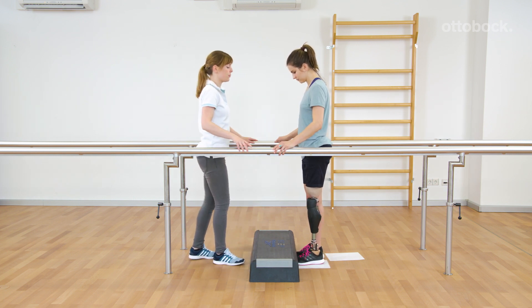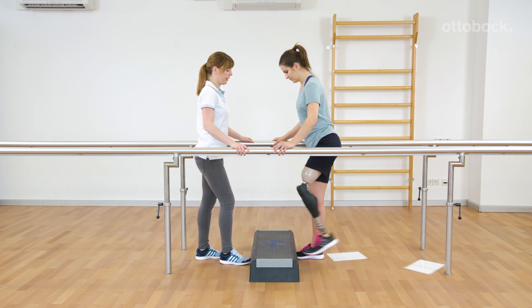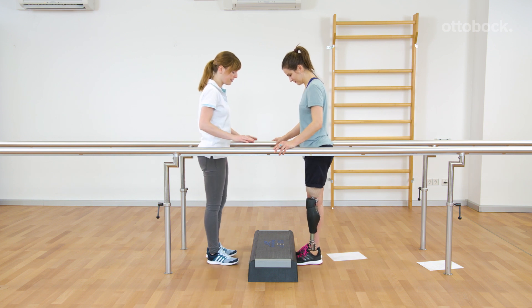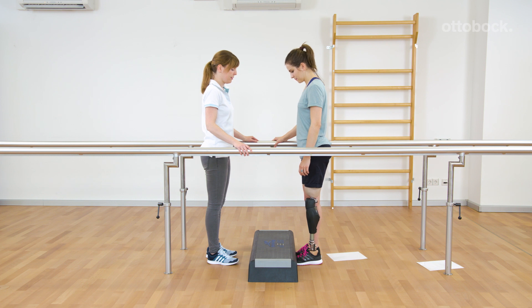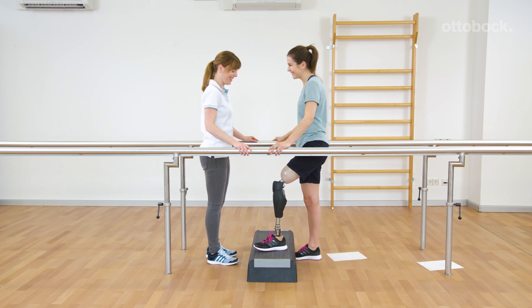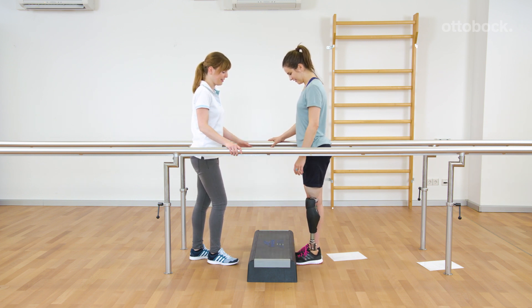At the beginning, it's okay to over-exaggerate the movement. The goal is to perform the pattern with the least effort possible. After triggering the function, the prosthetic knee blocks in the flexion direction and therefore supports foot placement and stepping up. A good socket fit is the prerequisite for using the function.